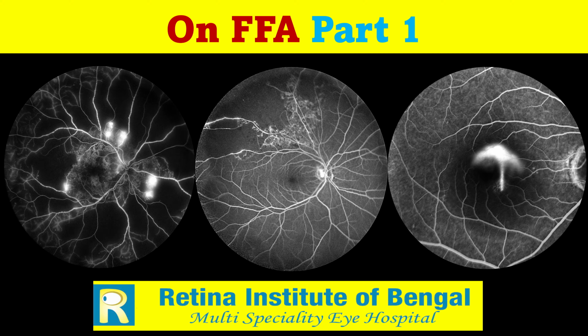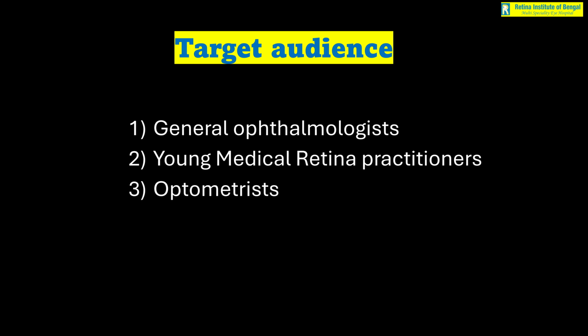So this is the first part, and this video presentation is primarily made with general ophthalmologists, young medical retina practitioners, and optometrists in my mind. So if you are, for example, a lay person, you may find this video very technical.